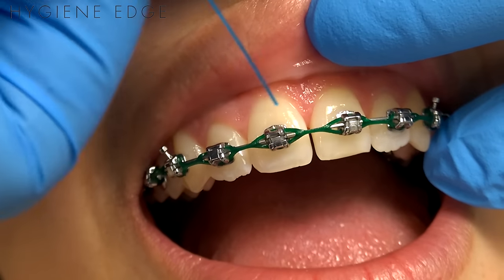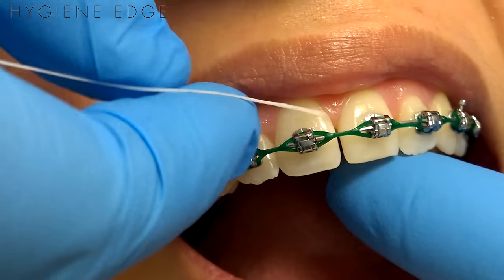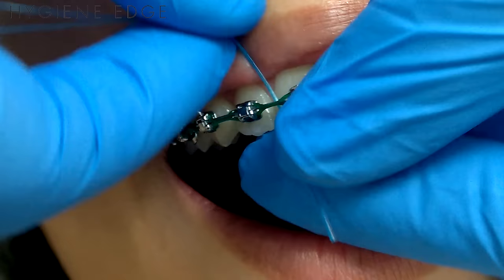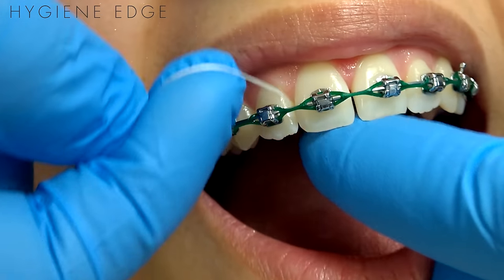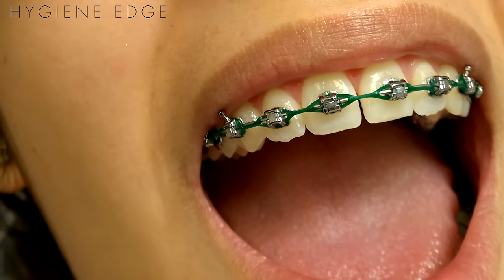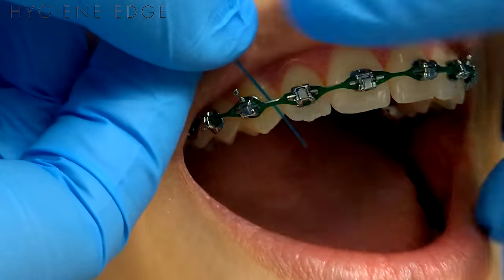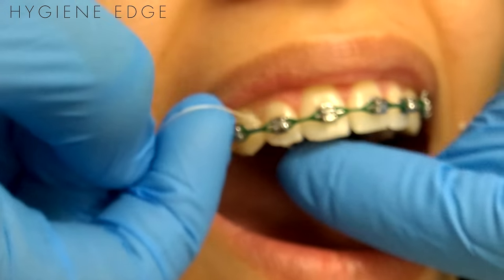When you floss the anteriors, instead of coming up and kind of poking your threader into the gingiva, stay down away from the gingiva. The biggest complaint I hear from hygienists is how long it takes, so they just don't even floss the ortho patients. But the more you do it the faster you'll get — just tough it out those couple patients and get a good feel of how to floss ortho.